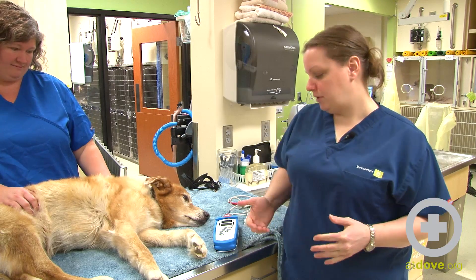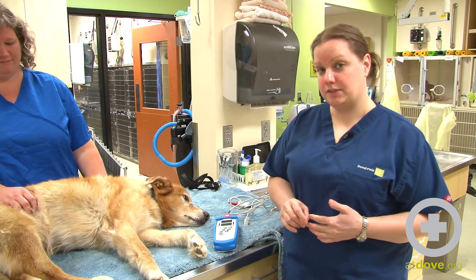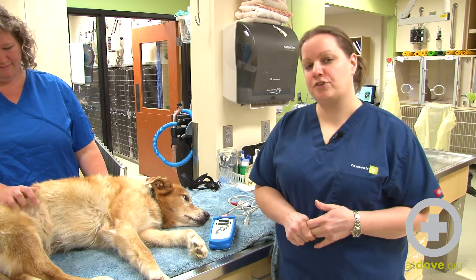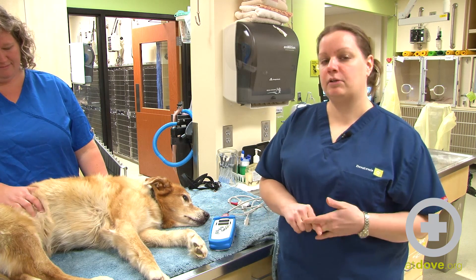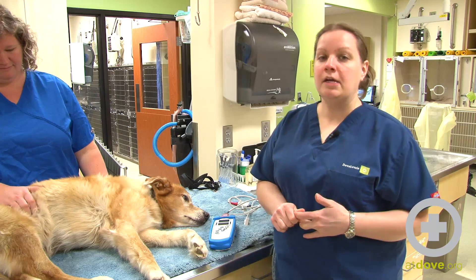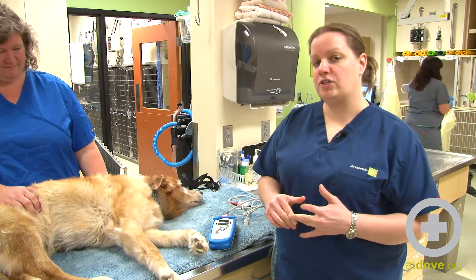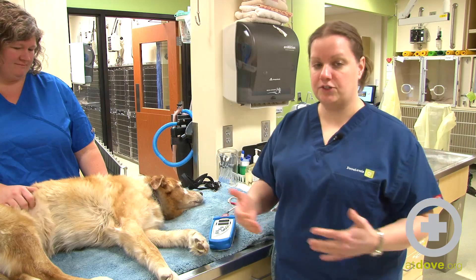Hi, I'm Megan. Today we're going to perform a Pulse Ox on this dog. This is our Pulse Ox machine, and what it's actually measuring is the percentage of hemoglobin that is saturated with oxygen. So it can give you an idea of how well your patient is able to deliver oxygen.